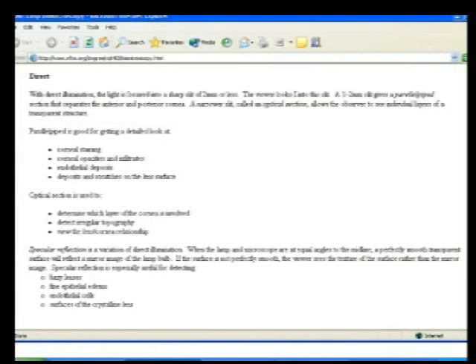All right, so beyond diffuse, we're going to go now to where we narrow the beam. And we can narrow it a couple different ways. We can narrow it down to a 1 to 2 millimeter, which gives us that illuminated block of corneal tissue called a parallelepiped. Or we can narrow it all the way down to a beam that's almost closed. It's an optic section.